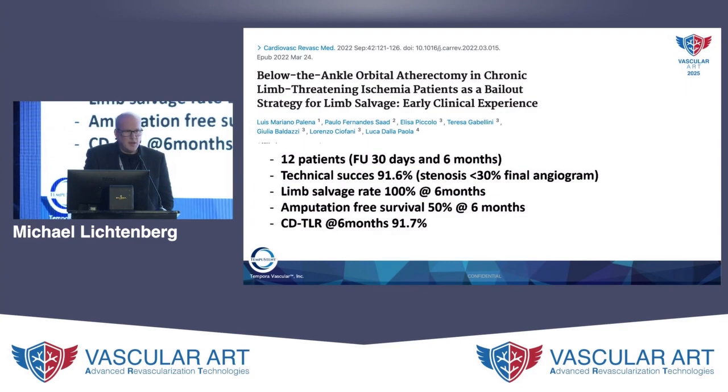So for the sake of time, we have a lot of new tools available. Unfortunately, the RCTs are missing. This is, I think, what is needed now: that we set up direct comparison trials to find out which modality is best for pedal intervention. Thank you very much.